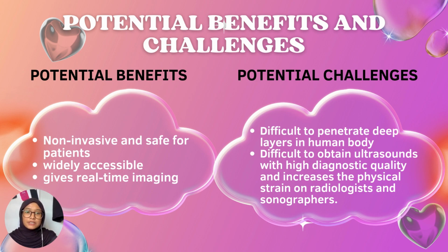The last benefit is that ultrasound gives real-time imaging. It gives a clear image of soft tissues and gives real-time assessment of moving structures, including the heart, blood flow, and fetal movement. Ultrasound also is the recommended imaging modality to diagnose and monitor pregnant women and also their fetuses.